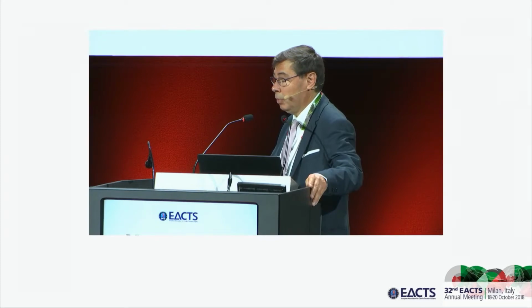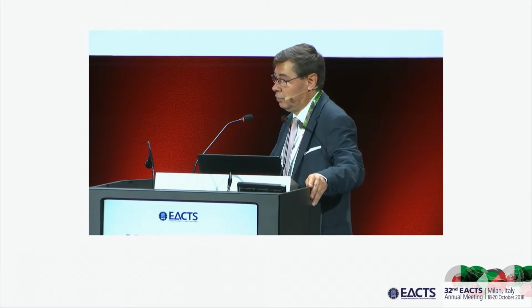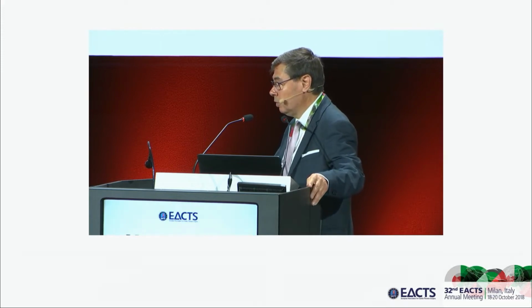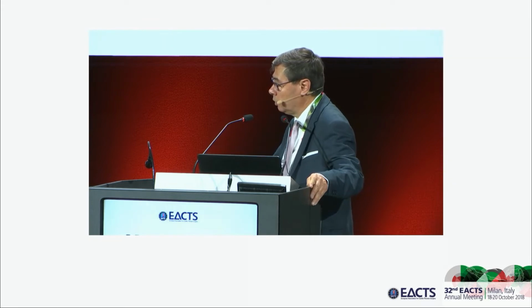I would not say that, because in bicuspid valve, quite often you will observe a billowing, even after a successful repair. And more often for bicuspid aortic valve repair, we will accept this. And of course, I think that Laurent will have the numbers to show you, but now we can make sure that even by leaving this billowing, we have a very good repair that can last over time. This is typical for bicuspid, actually, because they always look lower as compared to the tricuspid.